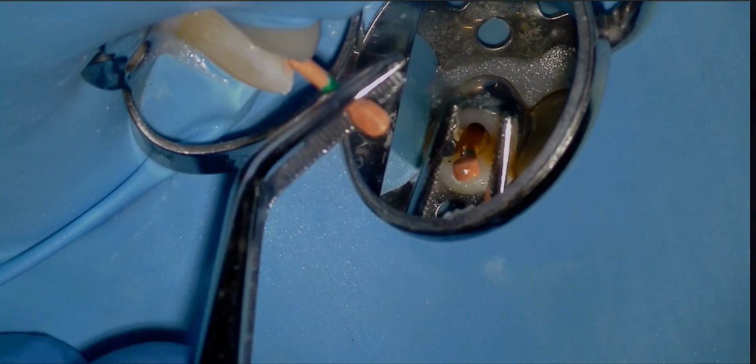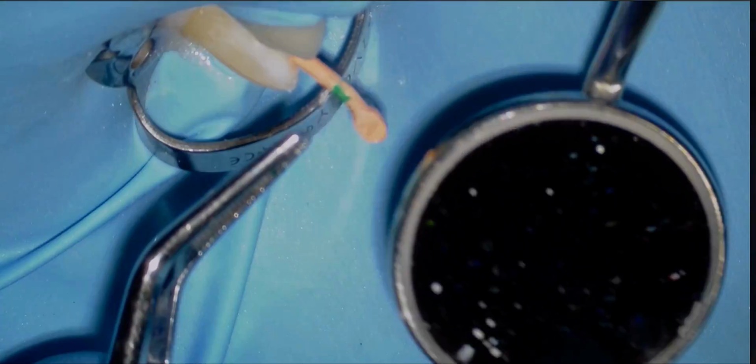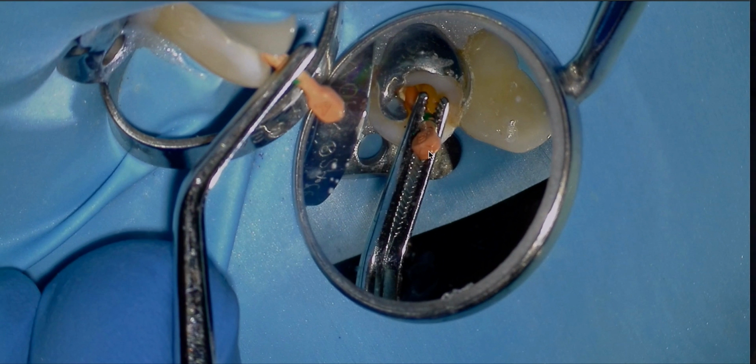Lots more rinse, more irrigation. And then what I'm going to do is I'm going to fit my cones. During the cone fitting procedure, I'm going to place my cones at working length. We're using a single cone technique with BC sealer. When I seat it, I'm going to give this a really good pinch, and that'll engrave my cotton forceps into the gutta percha.